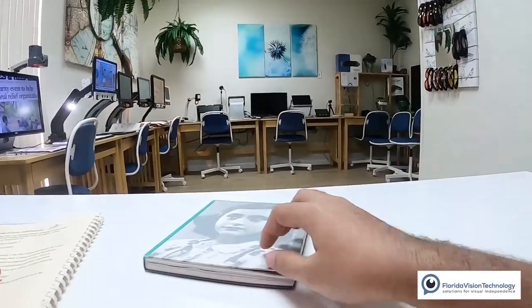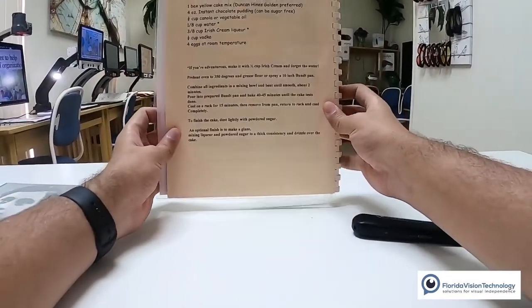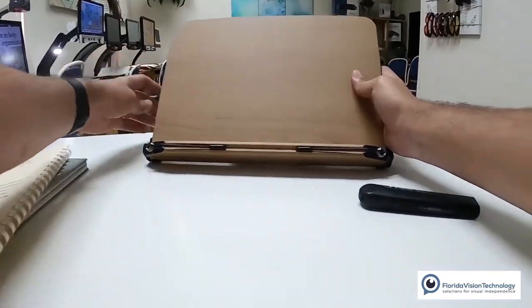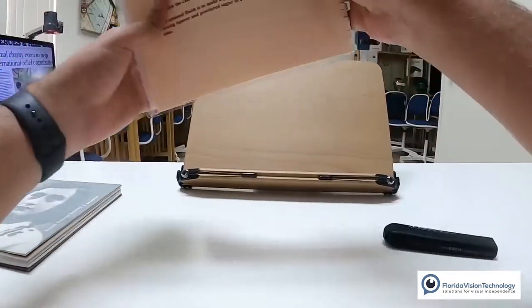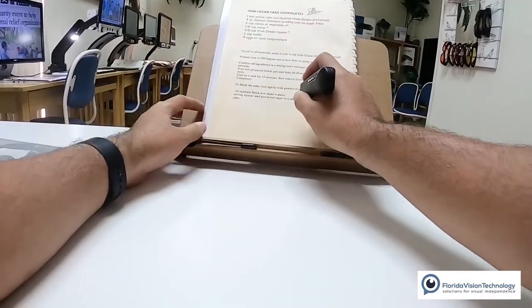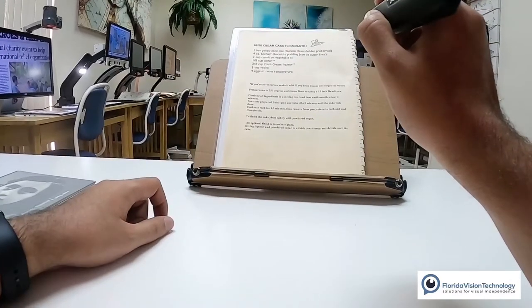Let's say you want to read a recipe. I have a little stand right here — I'm going to put it in front of me. Let's set that up quick. I'll put the recipe book on there. Let's take my OrCam again — I'm going to hold it about 12 inches away from the paper and press that trigger button.